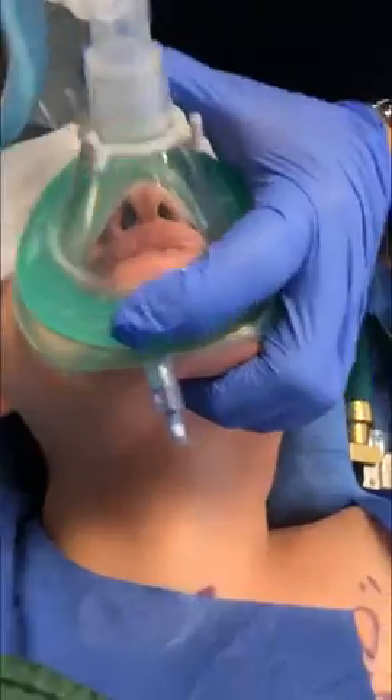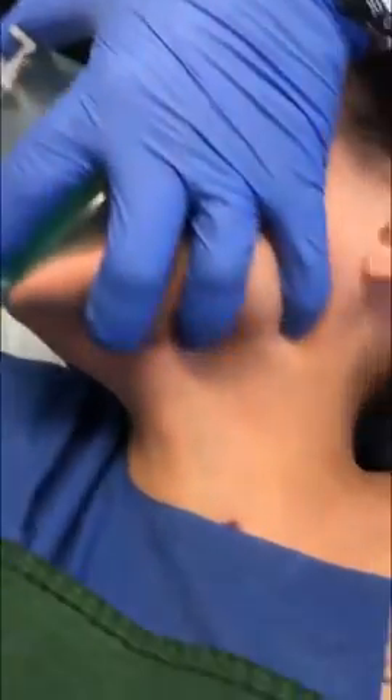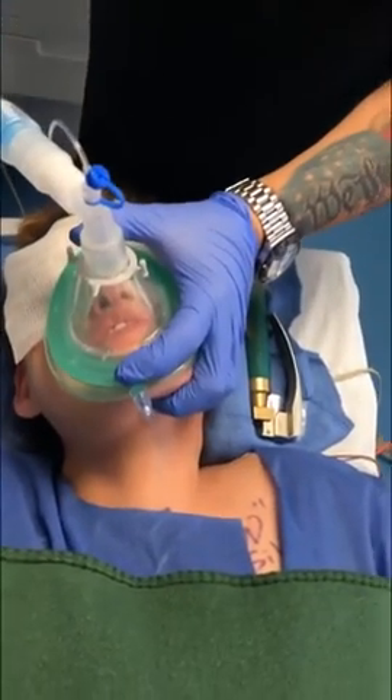All right, so in review, I make this kind of C-formation on the mask, and then over here on the angle of the jaw I use my other fingers to rotate and pull up, thus providing a really nice patent airway. I don't even have an oropharyngeal airway in, and she's very easy to ventilate. Just beautiful.